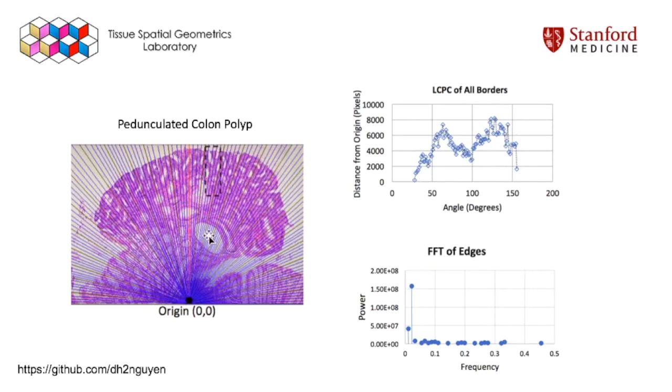capture the spatial information of the tubiness, all the tubes inside this polyp, in the form of this sinusoid wave, and then you can do the fast Fourier transform on this wave to get a frequency signature representing this shape and the arrangement of tubes within it.